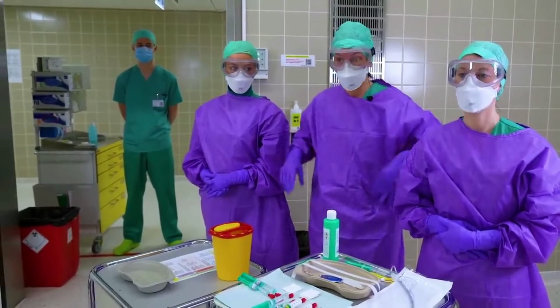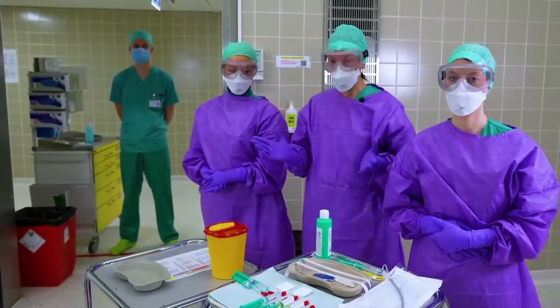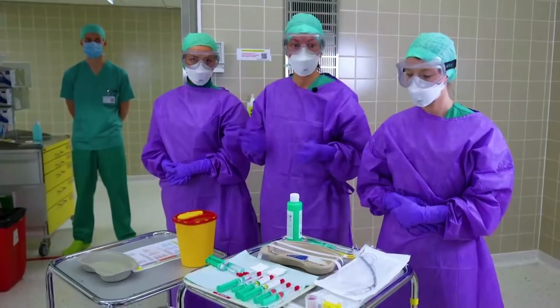Our concept is divided in 3 phases. We have the planning phase, intubation and extubation, as well as post-operative care. All these phases are equally important.